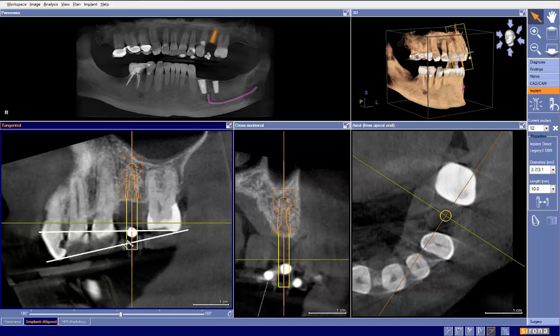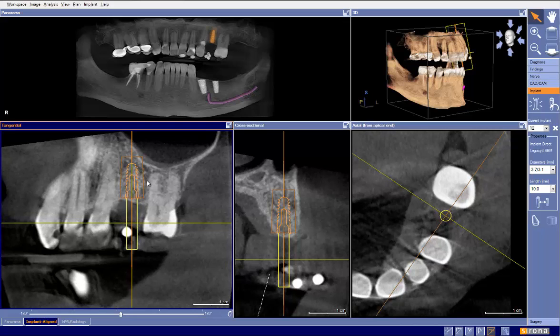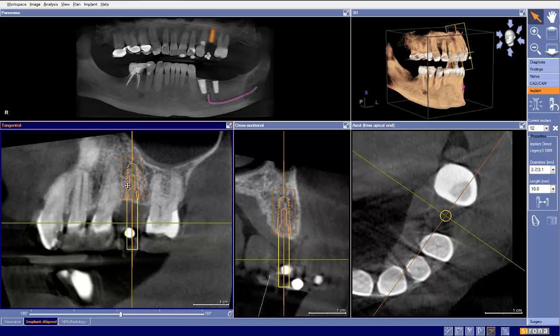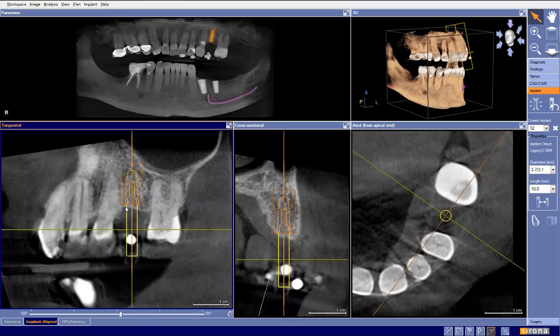So this implant is malpositioned to not allow us to do that. So what are our options to fix that? That is going to be a tilt function. So we're going to tilt this implant to the distal to the mesial on the apical end of the implant, and now we're going to move that until we get that a little bit more level. Now we've gotten that level, but now the issue we're dealing with is, again, now we're to the distal here. So we're going to move this over a hair, and what we may find is that we can't get it absolutely perfectly level, so we're going to have to accept a little bit of a compromise like so. And this is not horrible of a compromise at all, but it is definitely better than where we started, okay?